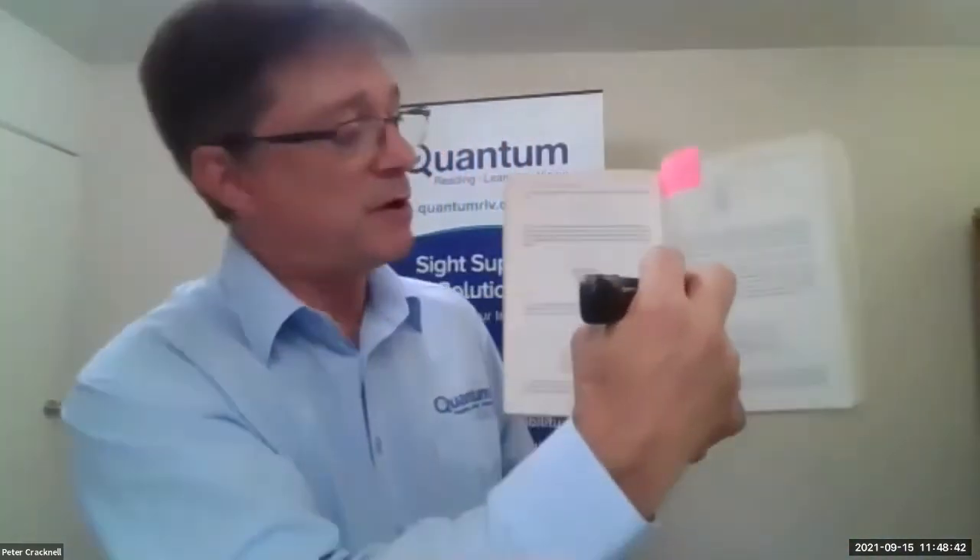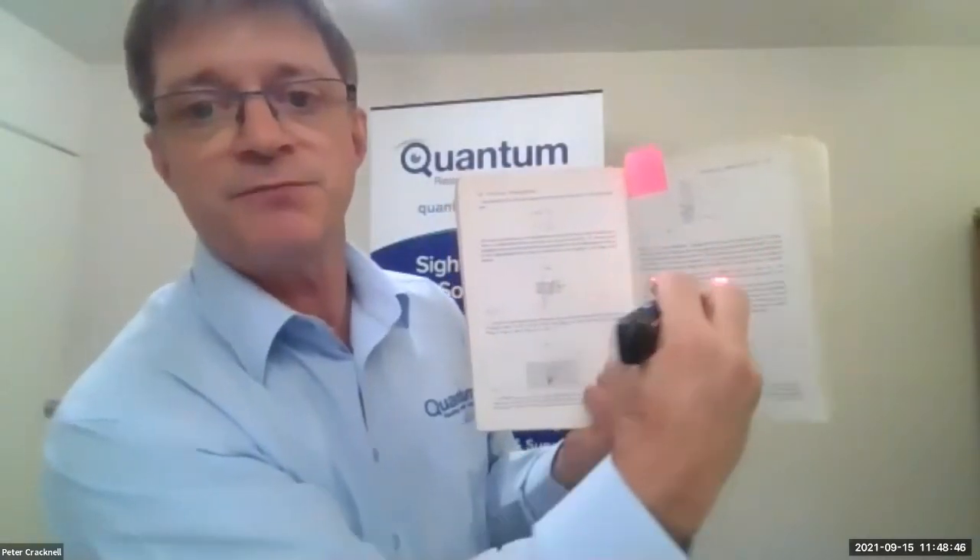I could choose to read the whole page or a larger block by changing the mode. I press a combination of buttons on the OrCam Read and it changes from a laser pointer mode to a box mode. And you can see that as I pull further away, I can see more or less of the text — theoretically, if I was far enough away, I should be able to get the whole book in.